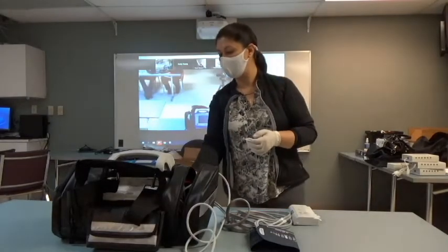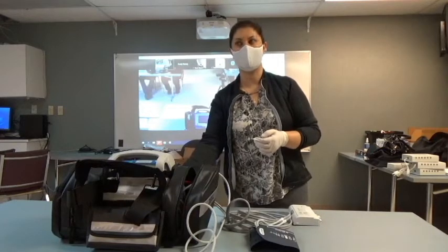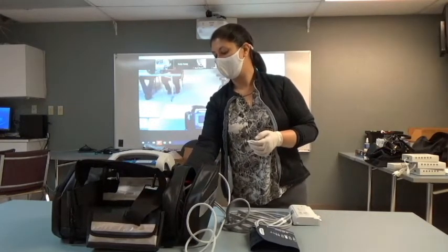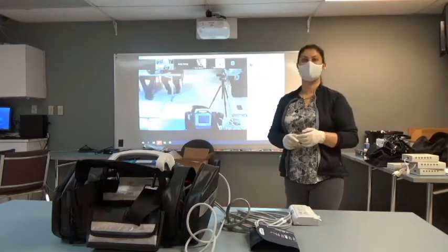Down at the bottom, you have all your energy, you have a pacer, you have an analyze for an AED. You have number one, energy select, number two, charge, and number three is your shock button.